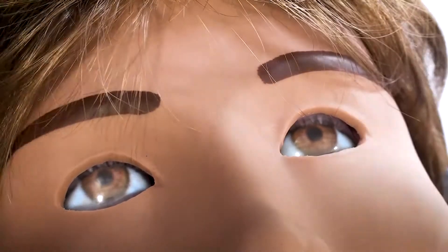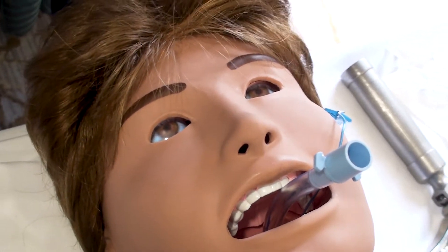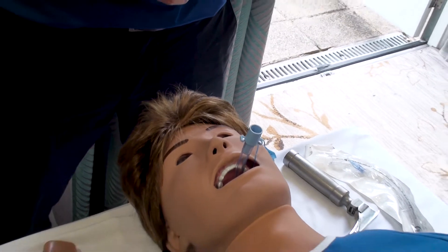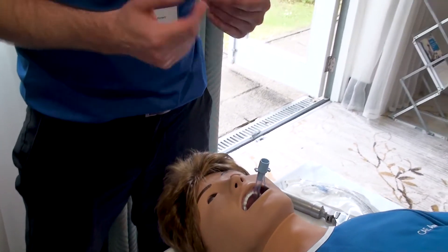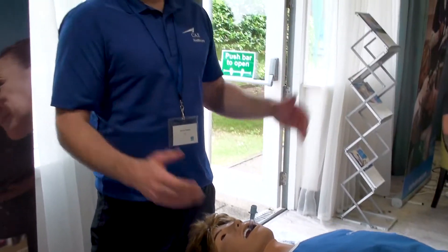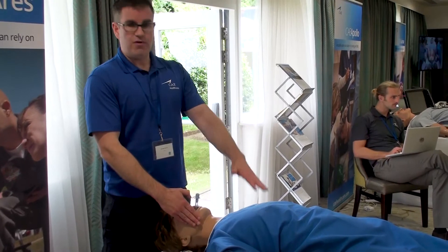Her airway is an advanced airway — we can intubate her with an ET tube, LMA, or iGel. We can intubate her incorrectly, so we can do a right main stem intubation or go into her stomach. All the airway adjuncts you'd expect are supported, and you can also perform a surgical cricothyrotomy as well.